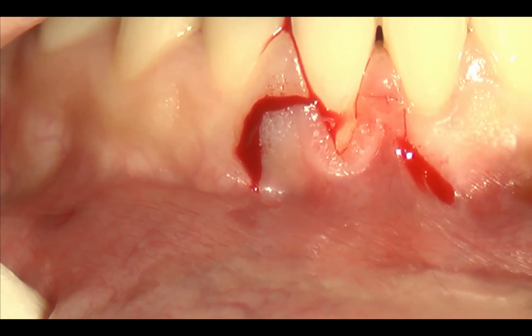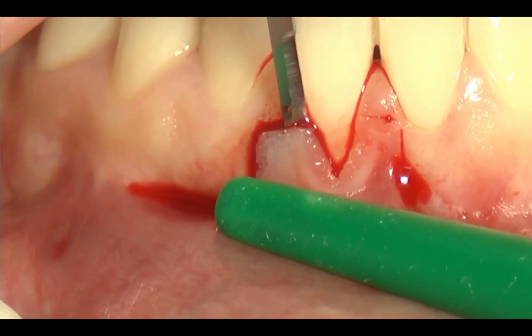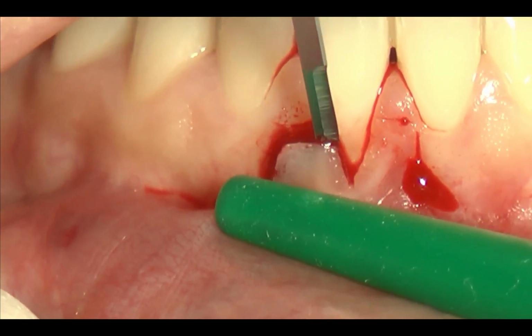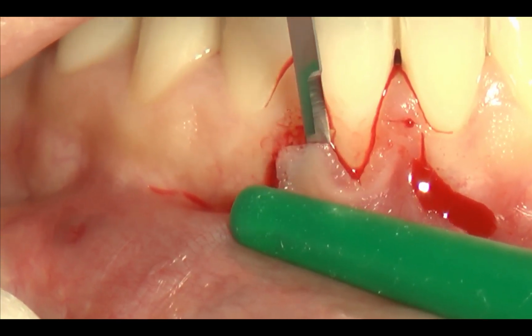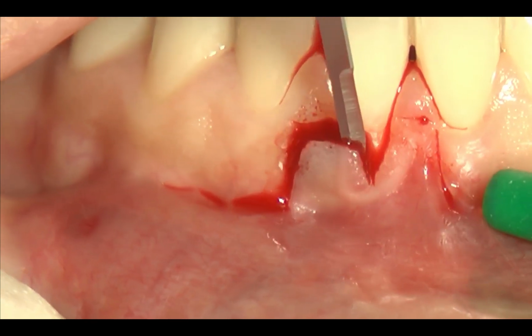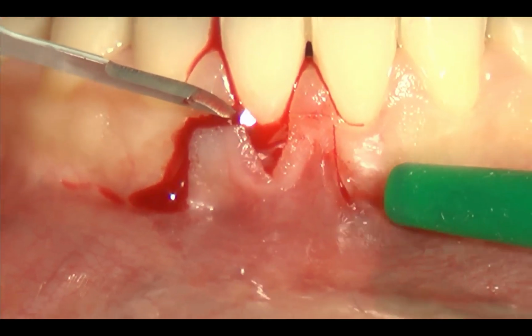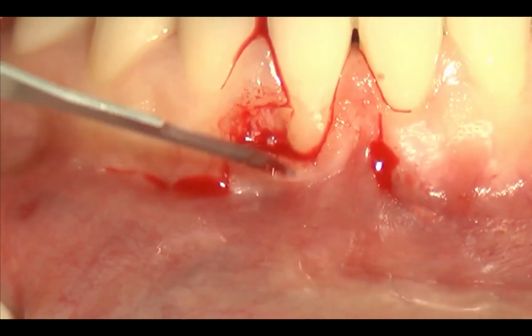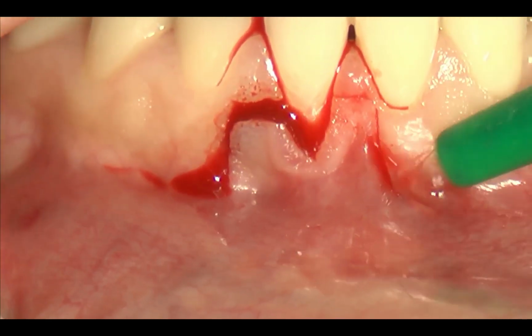The split thickness elevation of the papilla ends once you are able to elevate the whole papilla, until you reach the probable area of the keratinized tissue. This is called split thickness papilla.